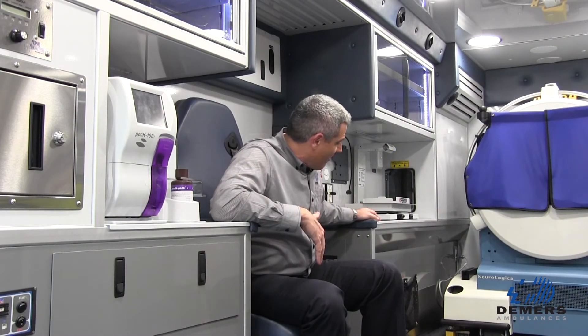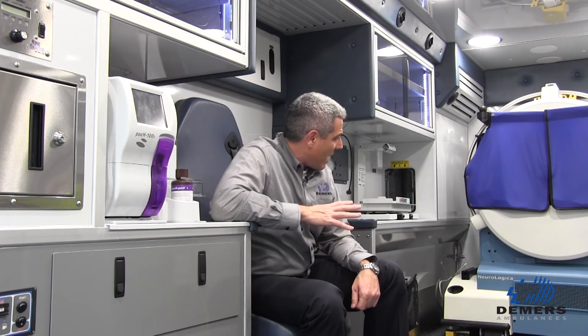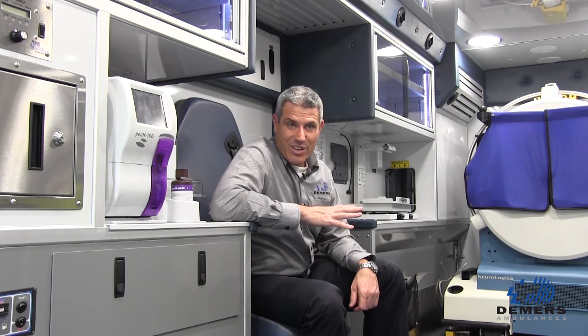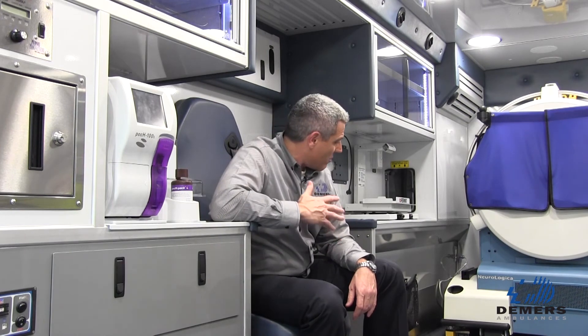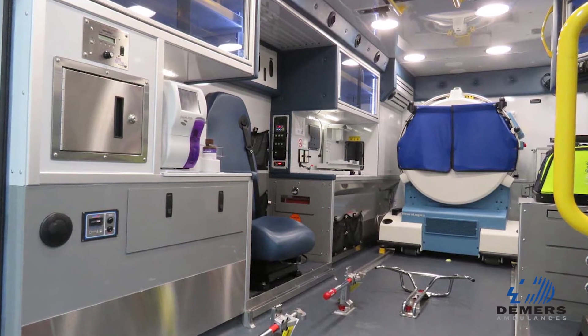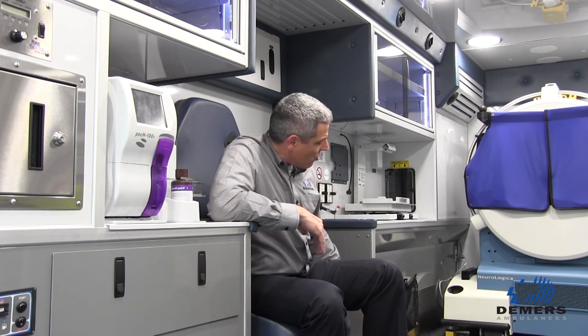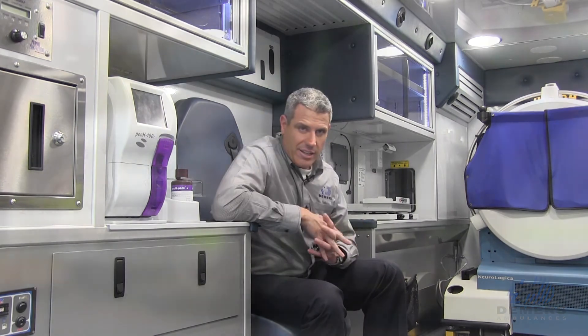One of the aspects that you hardly notice but is a very important part of the design is how we recessed the left-hand cabinet to be able to fit the scanner in. One of the challenges that the team had was making sure that the weights and balance on this vehicle worked out properly. The scan is a very heavy unit — you need to center it as much as possible. And to be able to do that in this vehicle, we needed some extra space on the left-hand side. The team had to redesign not only the cabinet but also all the systems that were tucked in behind it.